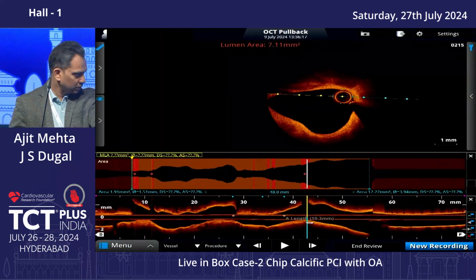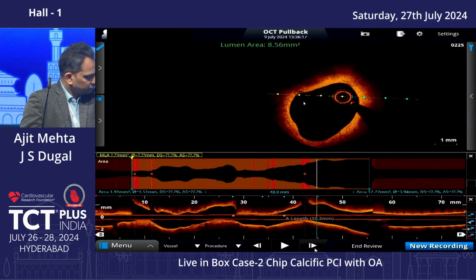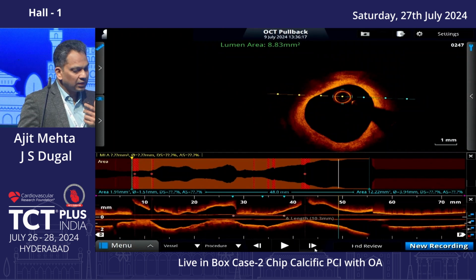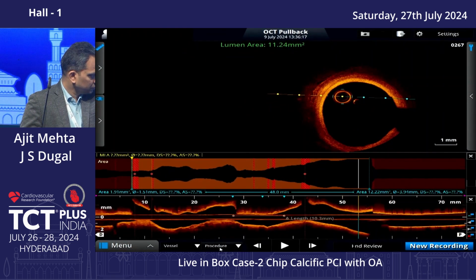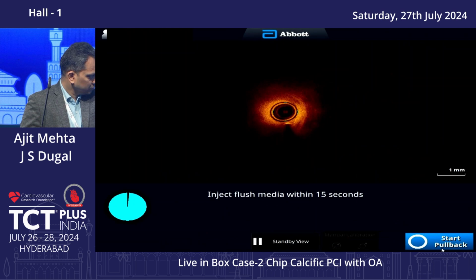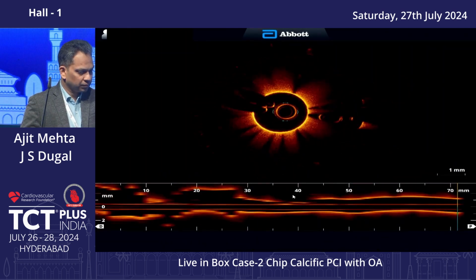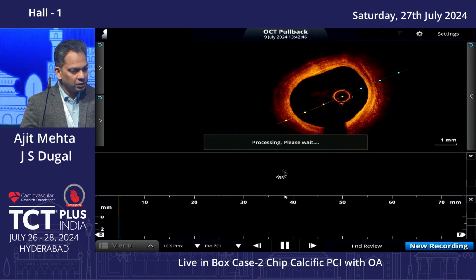So I do agree this is severe, but one choice is you can go like the regular balloon or cutting balloon can be fracture. And this is actually one of the things where Ultron 2.0 is useful because of the software, you won't necessarily make that same mistake as you make with your eyes when you think that it's extending throughout the whole vessel. So, okay, great.